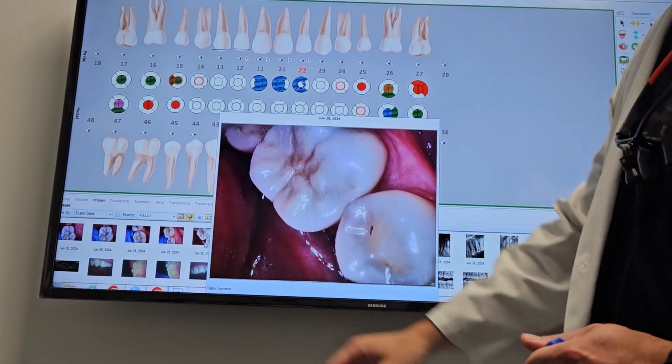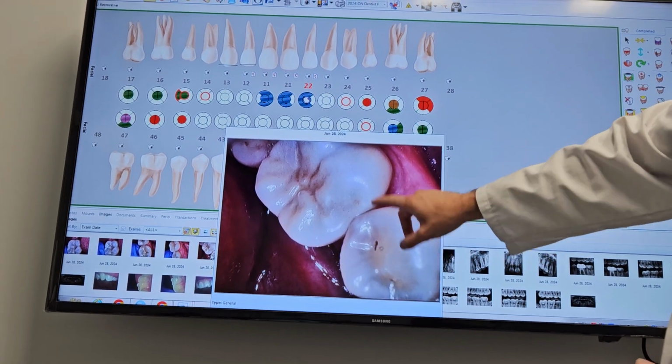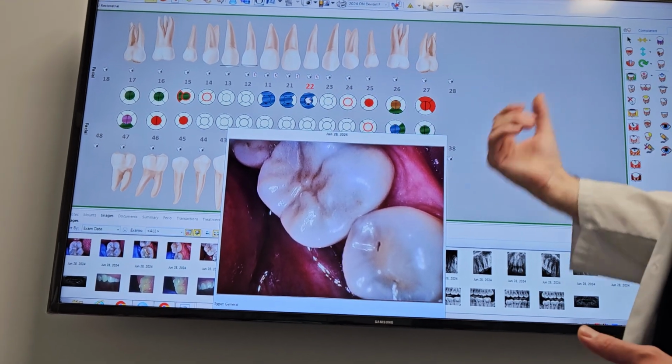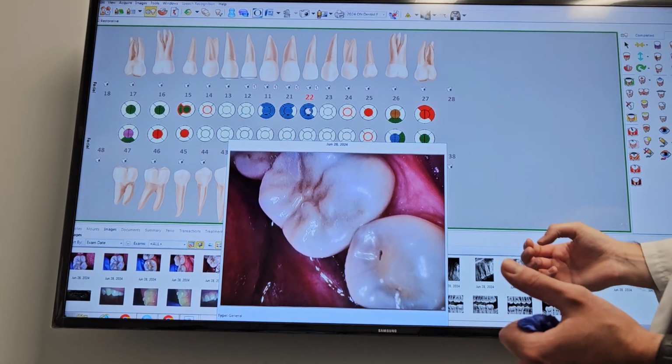I'm going to show you the bottom left here. We're monitoring this one. It's not too bad on X-ray. Which number tooth is that? 35, right, under the 25. And a lot of times you see the cavities come either this way or this way, because when you chew and eat, the food touches the surrounding areas, so the bad bacteria spreads.